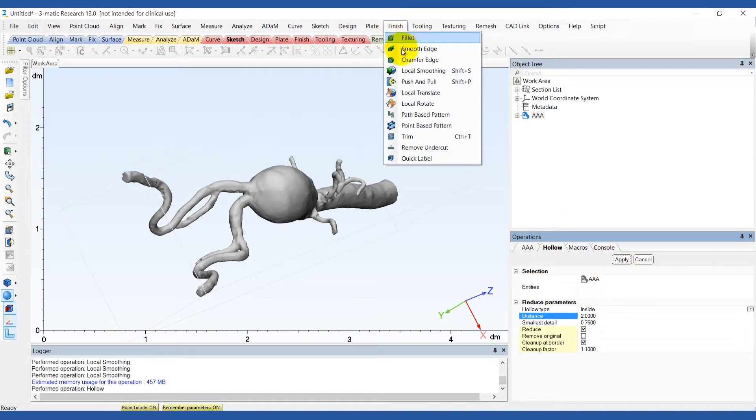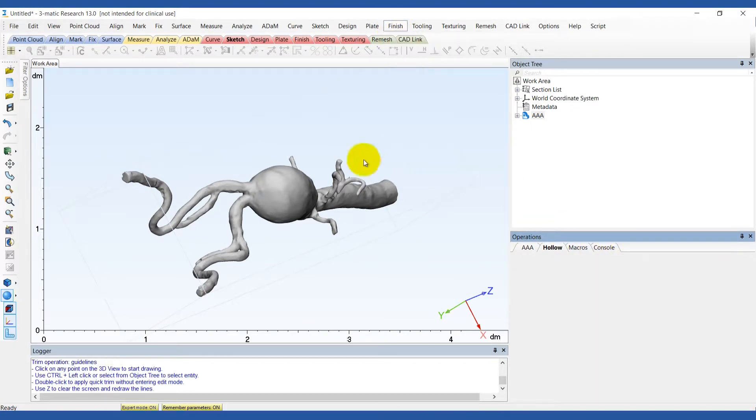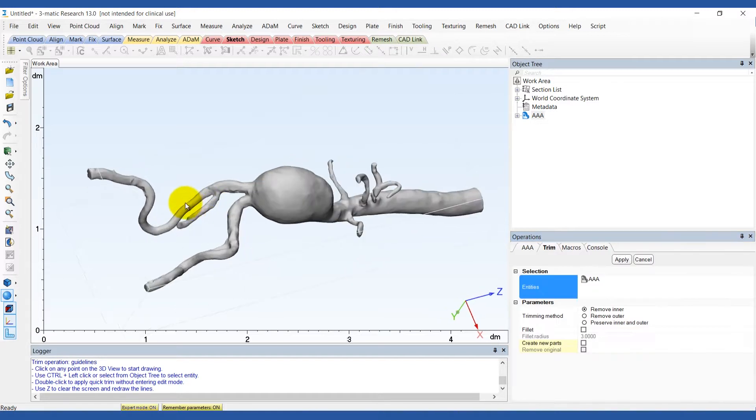To cut off the ends of the inlets and outlets use the trim tool under the finish menu.